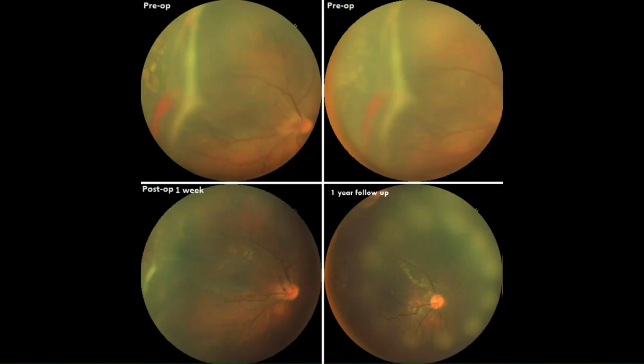A timely intervention in the form of lens-sparing vitrectomy with proper technique can result in a very good outcome both anatomically as well as functionally, especially in stage 4A ROP.